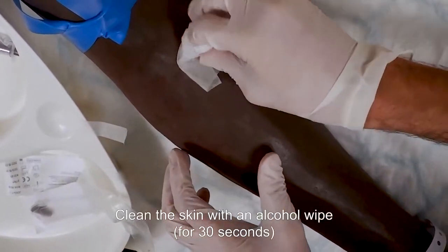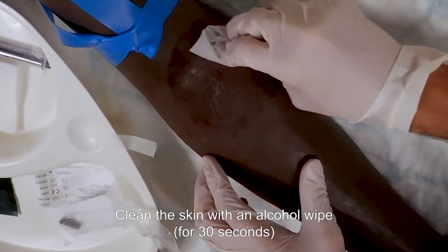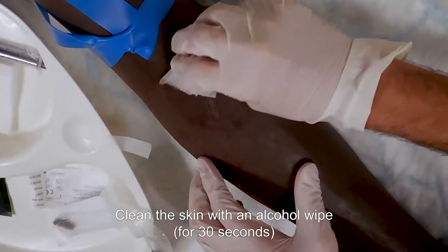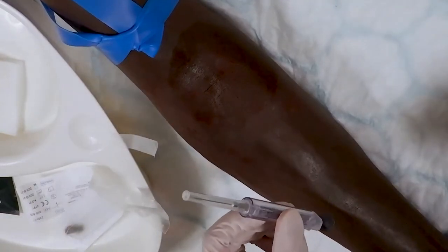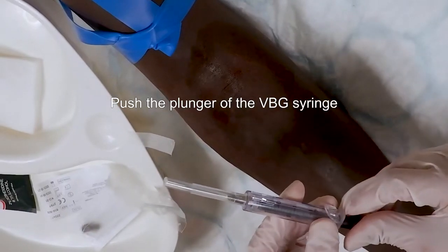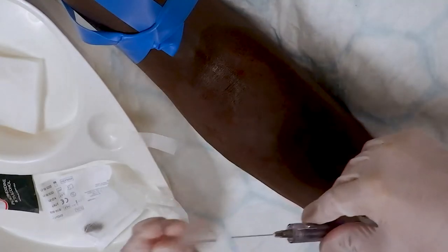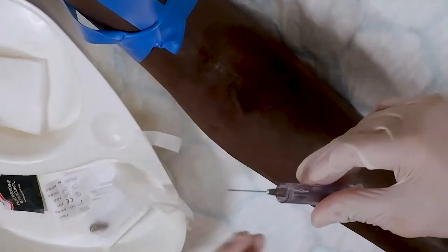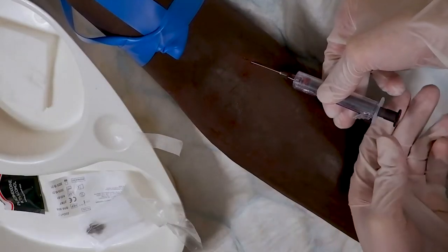Clean the skin with the alcohol wipe according to trust policy. Push the plunger of the venous blood gas syringe to expel any air. Always ensure the bevel of the needle is facing upwards. Hold the VBG syringe and needle securely with fingers below and thumb above, and insert at a 30 to 45 degree angle into the vein.